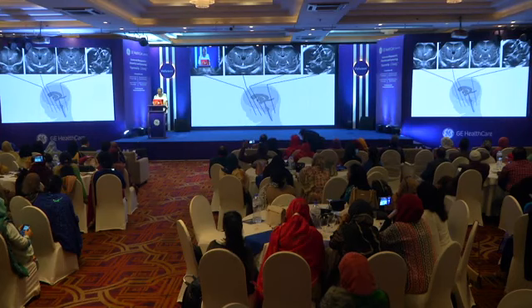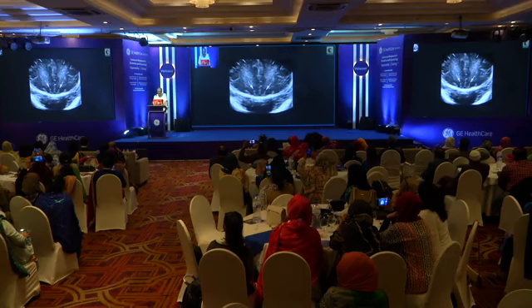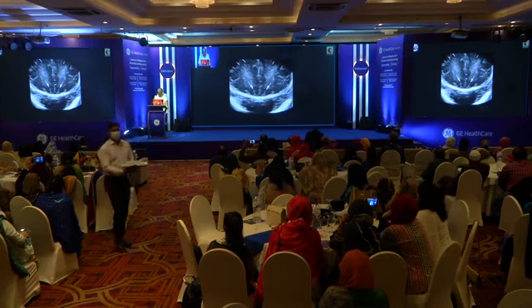And as you go further back, you will notice the 2 halves of the cerebellum as well as the occipital horn. Remember that later in pregnancy, after about 24 or 26 weeks, if you look at this level near the sphenoid, you'll also be able to pick up the olfactory sulcus, and that can be very useful for syndrome identification.